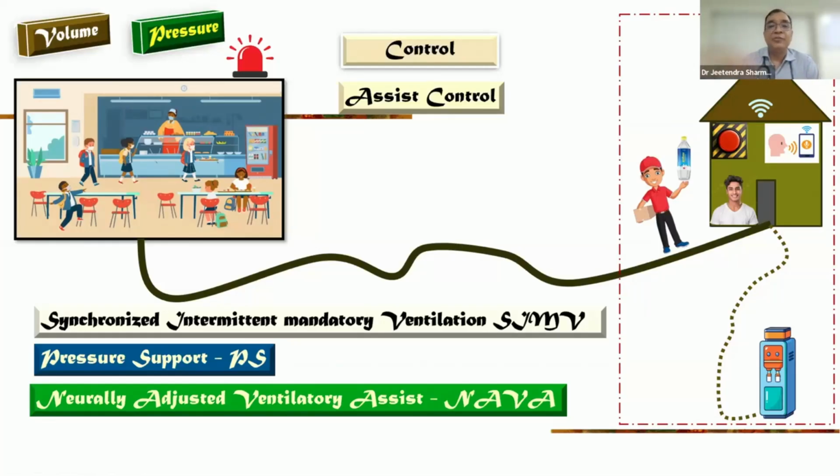Till now, the delivery boy wasn't participating in any communication. Now, whenever you give an instruction to the delivery boy, if he carries out the instruction next time without going to the manager, this will be an advanced one. What we call closed loop ventilation, where the patient and ventilator interact themselves without much involvement of the clinician.